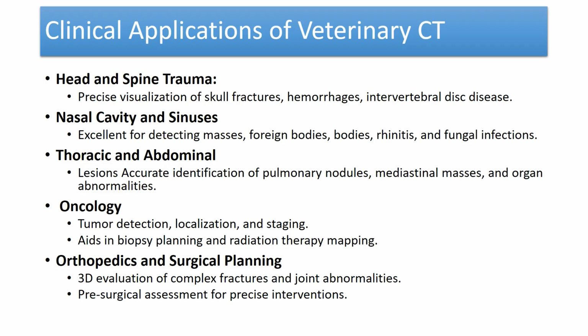Clinical application of the veterinary CT. We can use the CT scan in the patient with head or spinal trauma to visualize skull fractures, any type of hemorrhage, and any type of intervertebral disc disease.